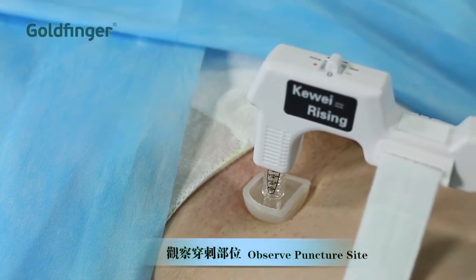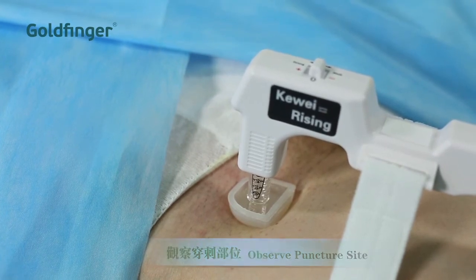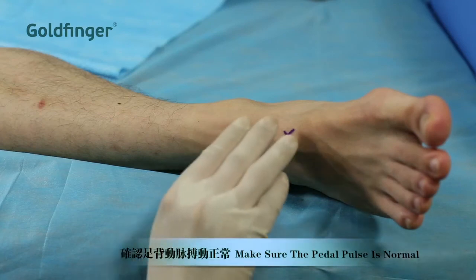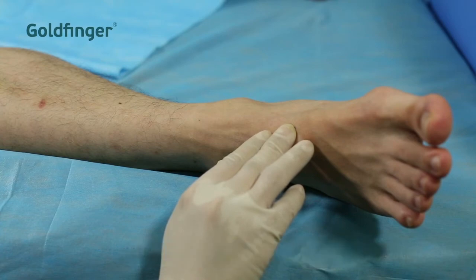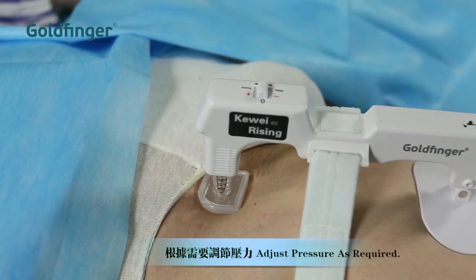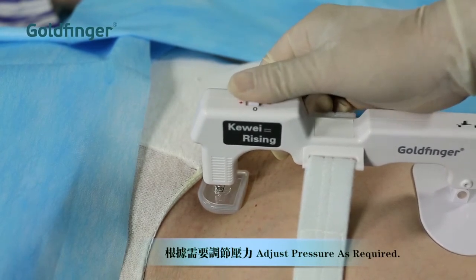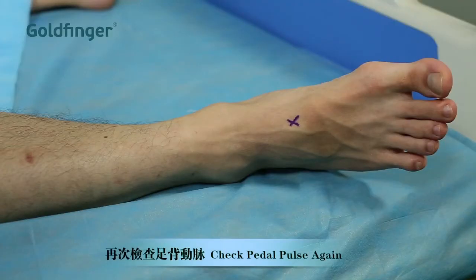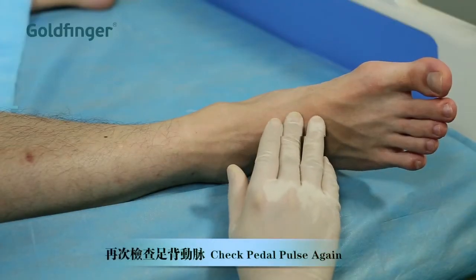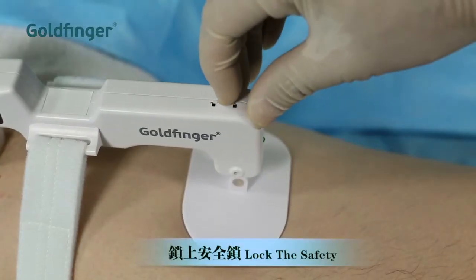When the device generates enough pressure, release the left hand. Observe the puncture site and ensure there is no internal or external bleeding. Palpate the pedal pulse and make sure it's normal. Adjust to the proper pressure, which will ensure both hemostasis and sufficient blood flow.